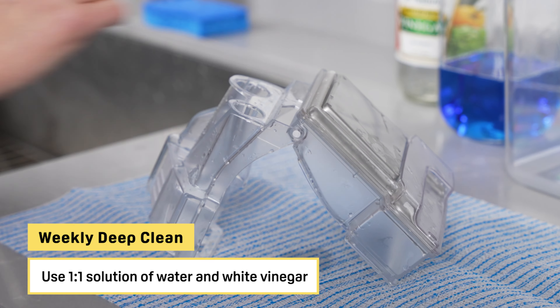The process for cleaning CPAP equipment is fairly quick. We'll run you through the cleaning materials you'll need and each step of the cleaning process.